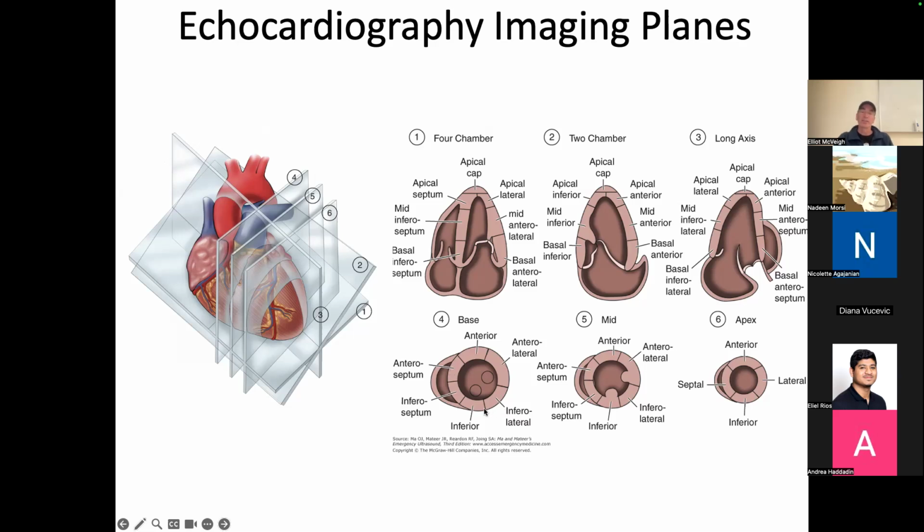These chunks, as you can see, there's 6 chunks there, right? We don't cut it into 30 chunks because usually you don't need that type of resolution to report an abnormality.